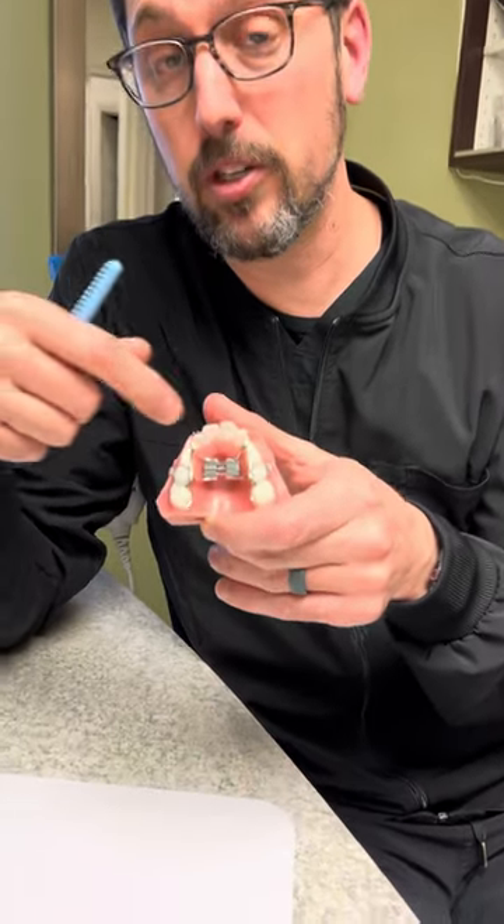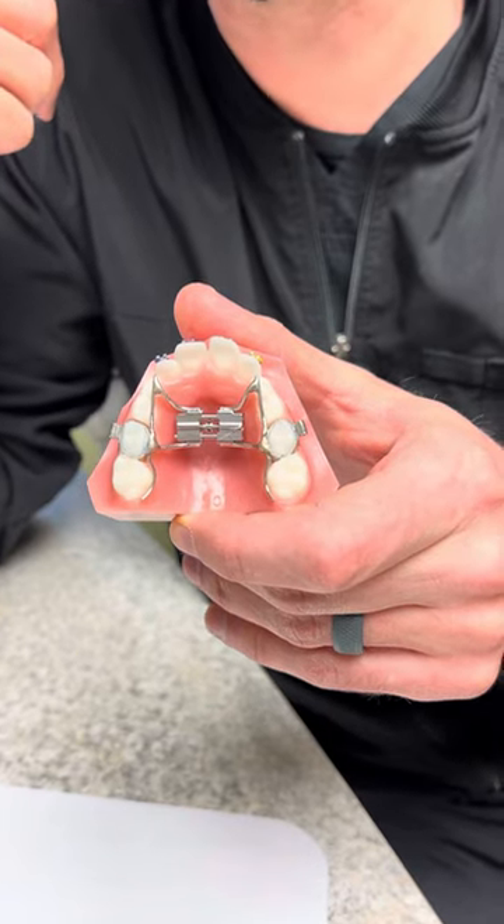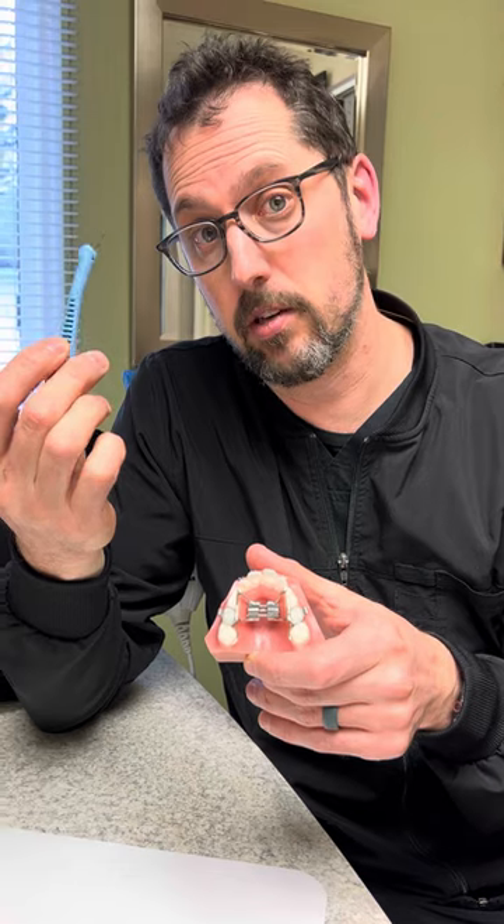The next really important portion of this whole expander thing is scrubbing it really good. You've got to scrub the center of it just like you're brushing your teeth — scrub right in the middle of it right there. You have to keep that spot clean because you're going to be using this expander key right here to be turning that.